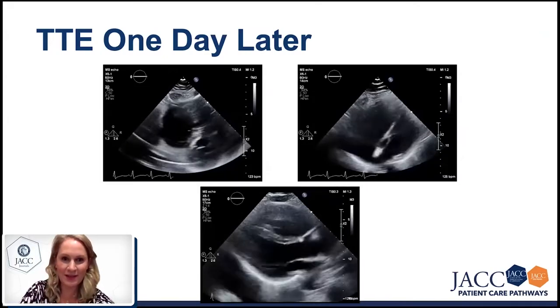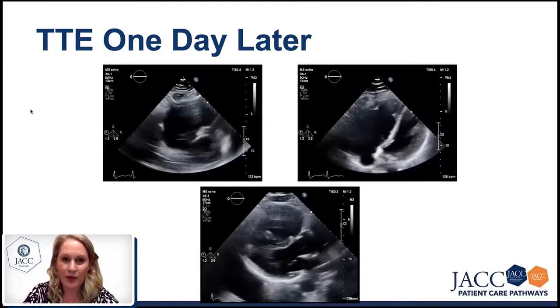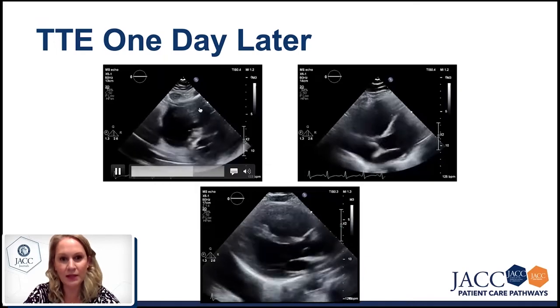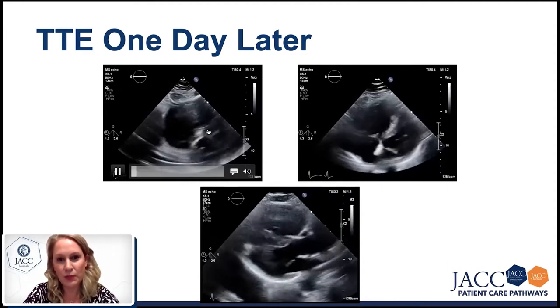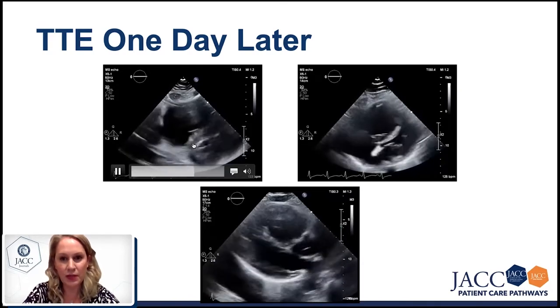So practically, on the upper left side, we have the short axis view. We can see that the right heart is dilated and significantly — I would say severely — impaired. The left heart is completely squeezed. And we have a D-shape in both diastole and systole.